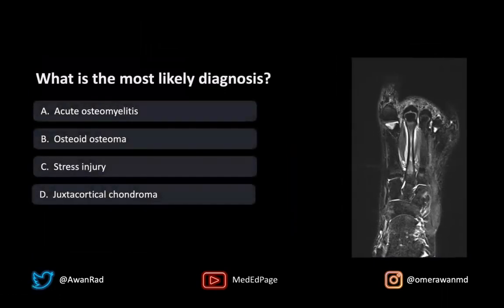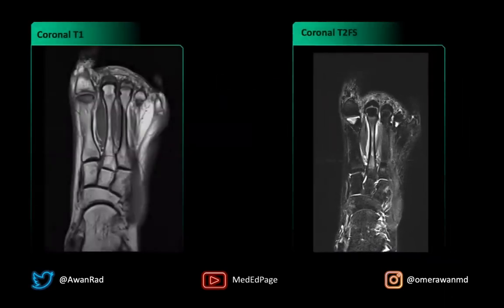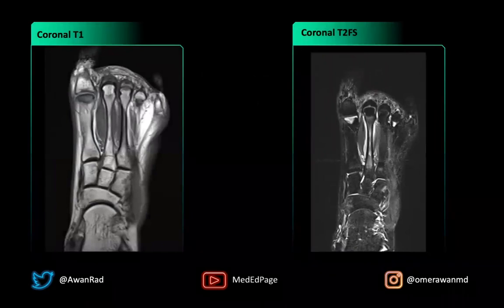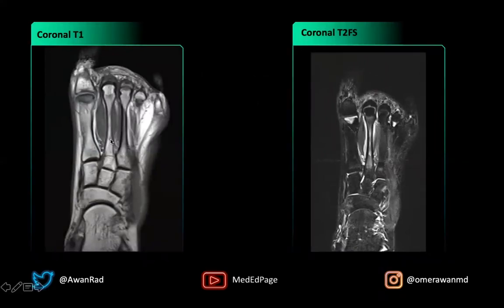This is a case of acute osteomyelitis, osteoid osteoma, stress injury, or a juxtacortical chondroma. Coming back to the images, notice that it's not a case of acute osteomyelitis because, first of all, we have a lack of soft tissue findings — there's no subcutaneous edema to suggest cellulitis, and there's no myositis or increased signal within the muscle. We just have very faint T1 dark signal on the second metatarsal and marked marrow edema on T2 with subperiosteal edema.